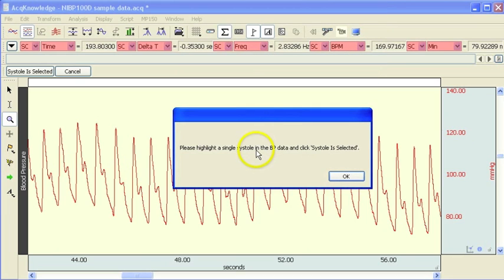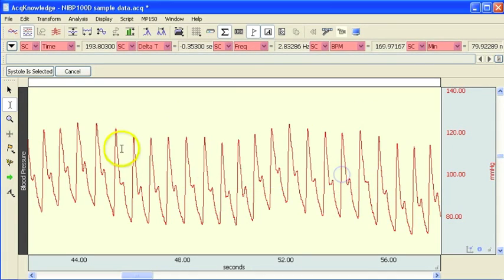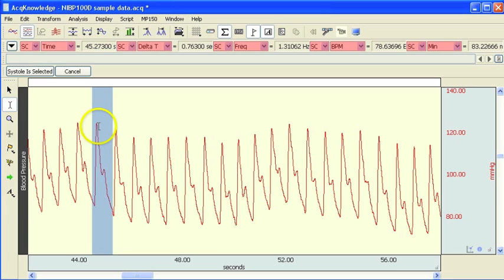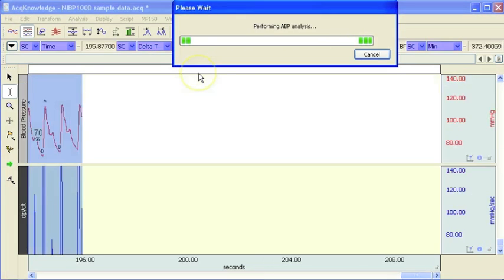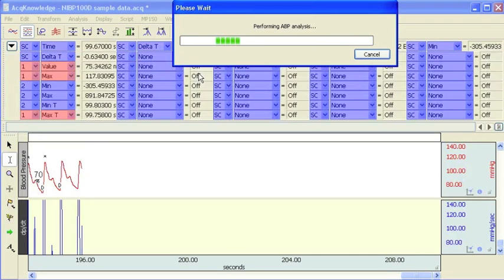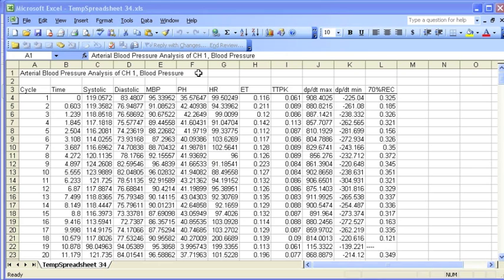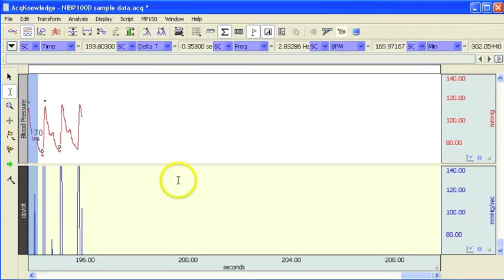We're now prompted to identify a typical cycle and make sure that we're highlighting the systole or the peak of systole. So I'm going to come over here, highlight one cycle where we've got one systolic point in there. Systole is selected. Now the software is running through and doing the analysis and we'll come back to that in a minute.